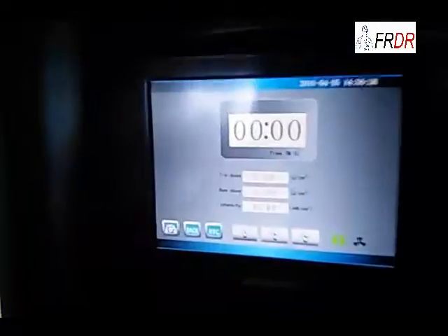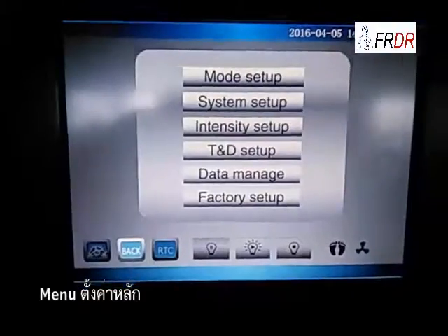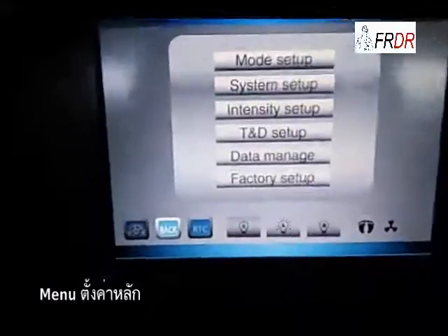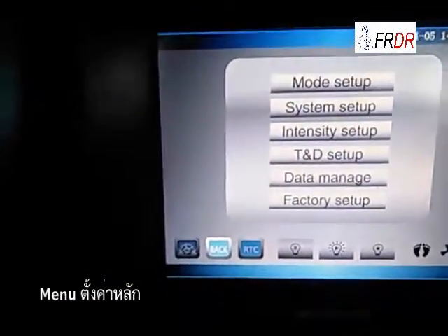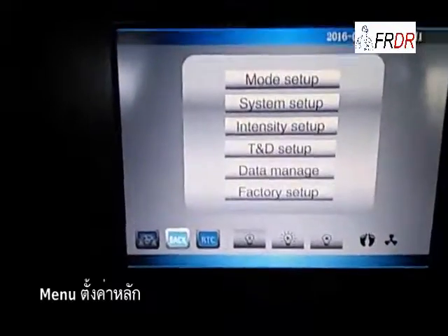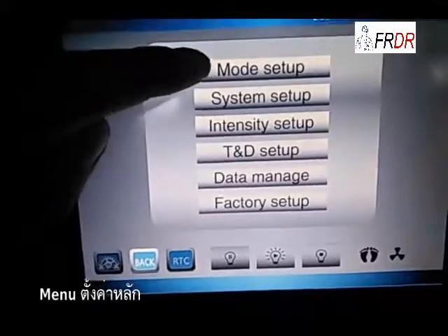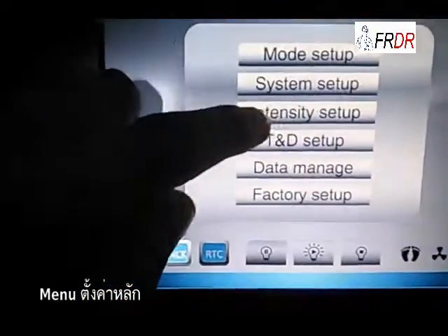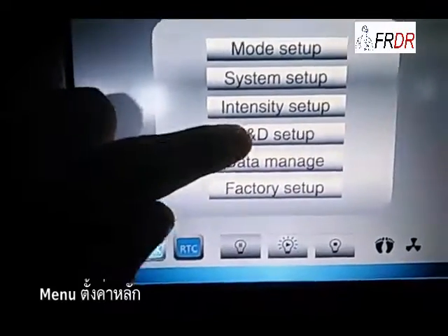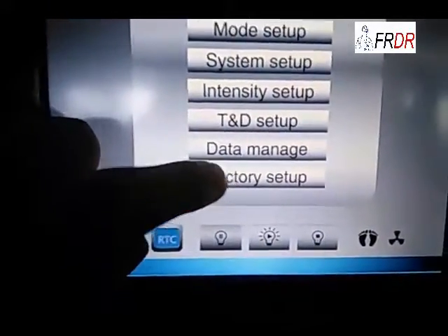And there's a touch screen. Now I'll show you how to operate this software. This is the touch screen, and this is model setup, system setup intensity, time and date setup, and data management. This is factory setup.